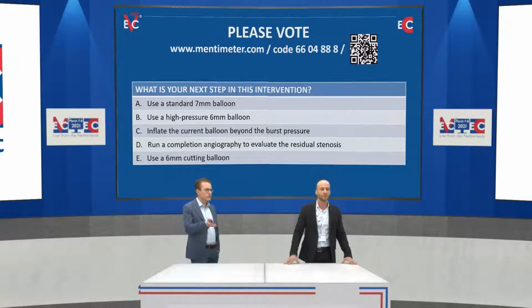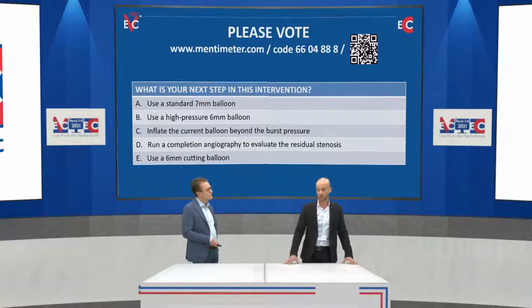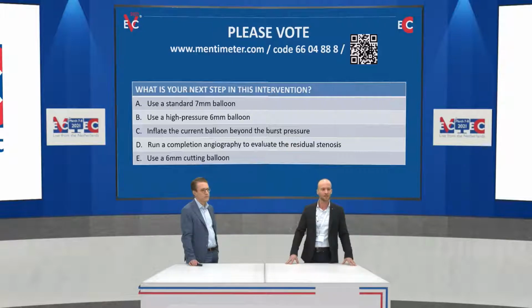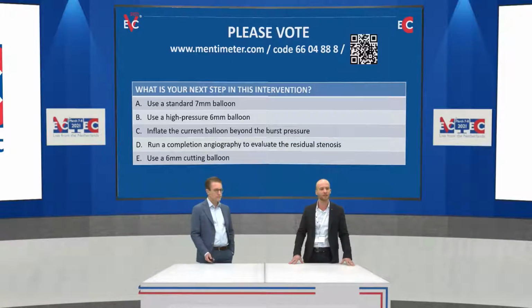Rutger, would you think that simply deflating the balloon and doing an angiography would be okay? No, you can do that, of course, but that's not solving the problem. You see a very tight stenosis still in the balloon itself. The balloon should be deploying all the way and not have this indentation. Yes.